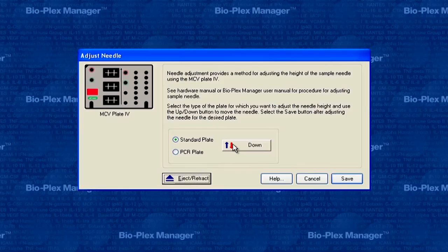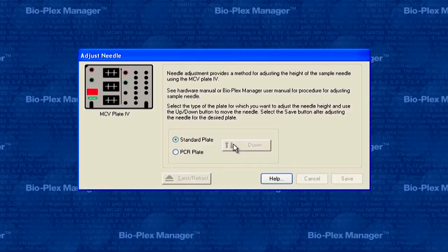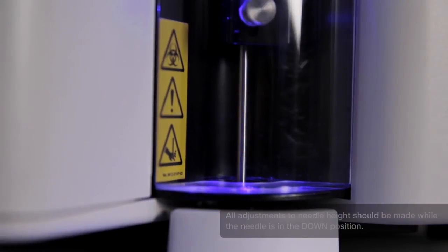Now, click on the up-down button in the Adjust Needle dialog box. The needle will move to the down position.